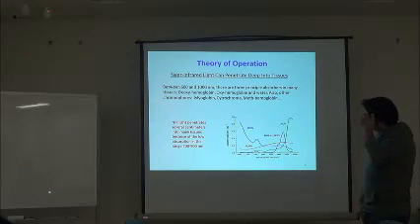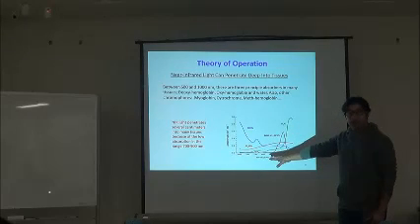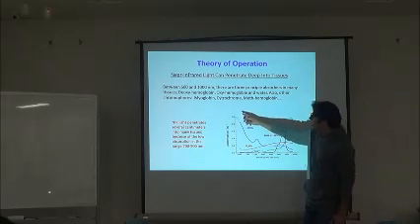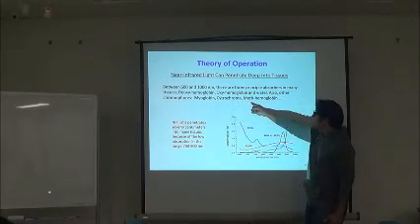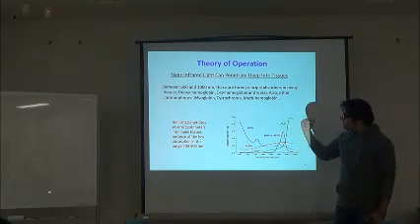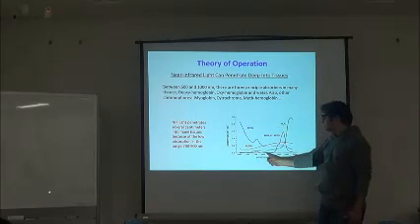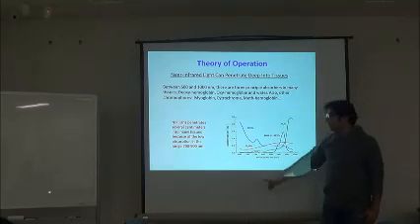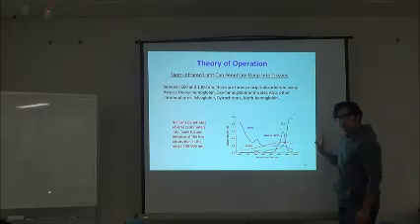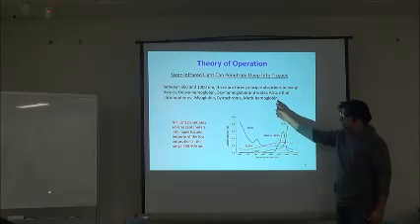Apart from these, there are some other chromophores also present in the brain, like I have mentioned here: myoglobin, cytochrome, methemoglobin, etc. But the absorption coefficient of these other chromophores is approximately zero or negligible at this wavelength. Maybe if we use some other wavelengths, then the absorption coefficient is high, but we don't want to do that because we want to neglect the effects of those.